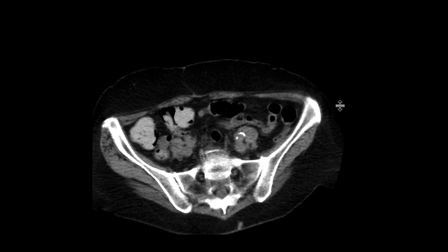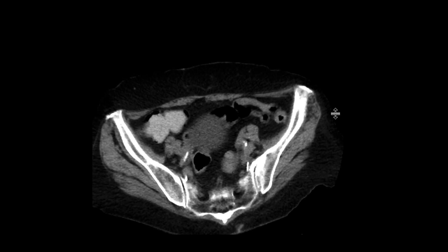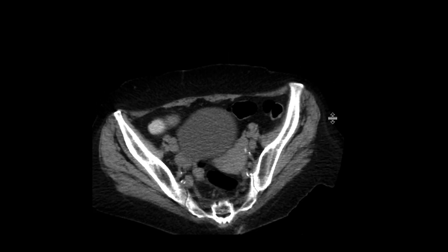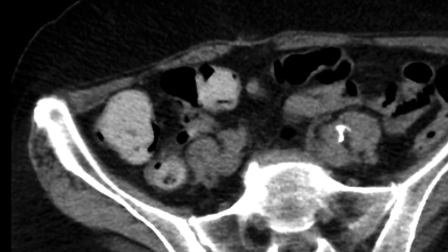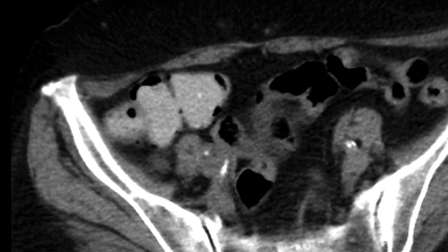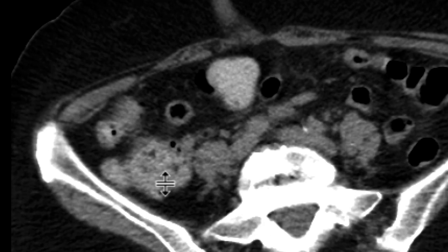Obviously, you need to look organ by organ and look at all specific blind spots. As we look at this really carefully in the right lower quadrant, we can see that there is a tubular structure here that's low in density and blind ending. Here we have the cecum, and we can see that right over there there's a structure arising from the cecum. That looks like the appendix.